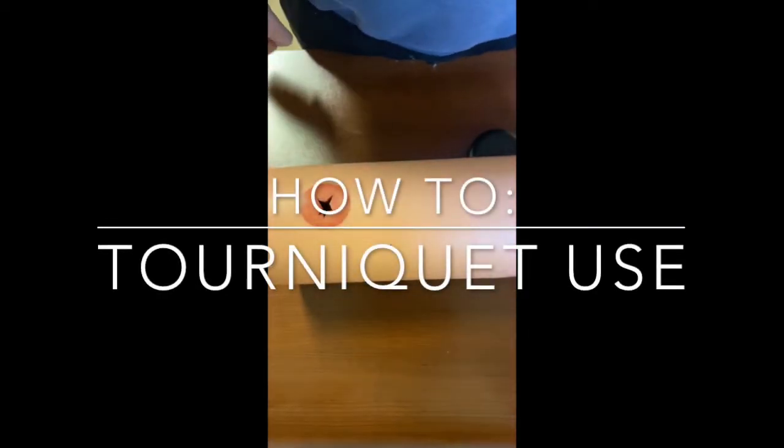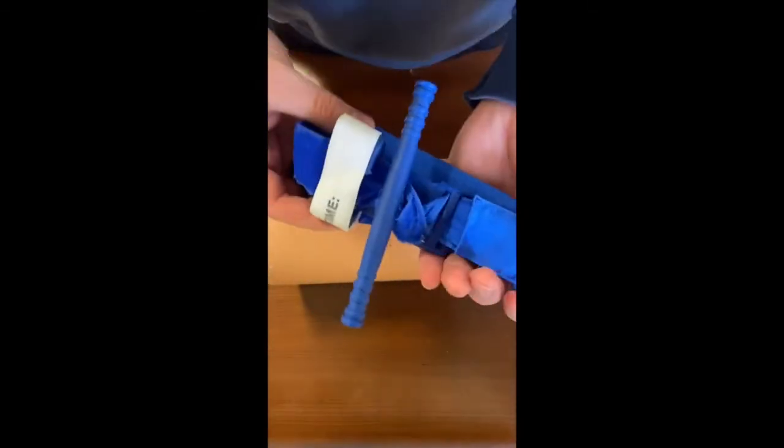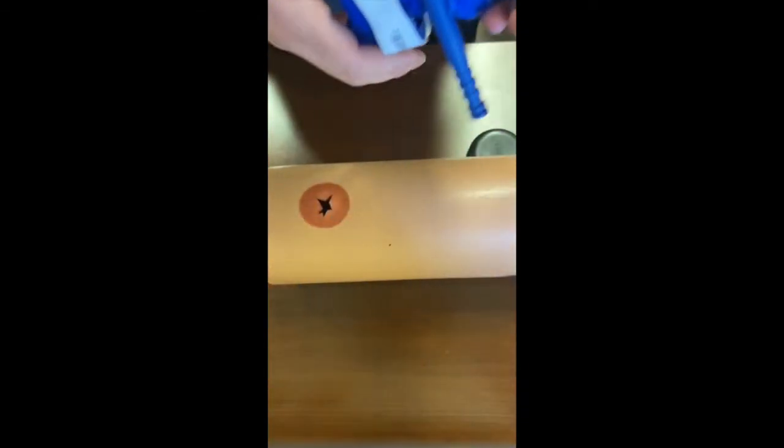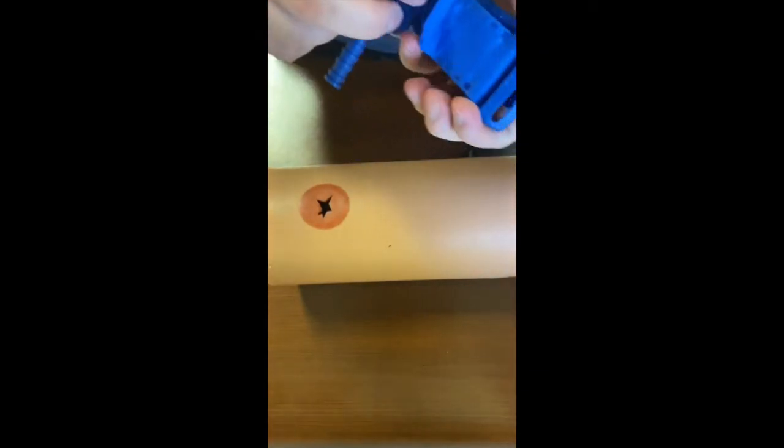Hello everybody, today we are going to be going over the usage and applications of a tourniquet. Tourniquets are used to stop traumatic bleeds in extremities, so arms and legs.